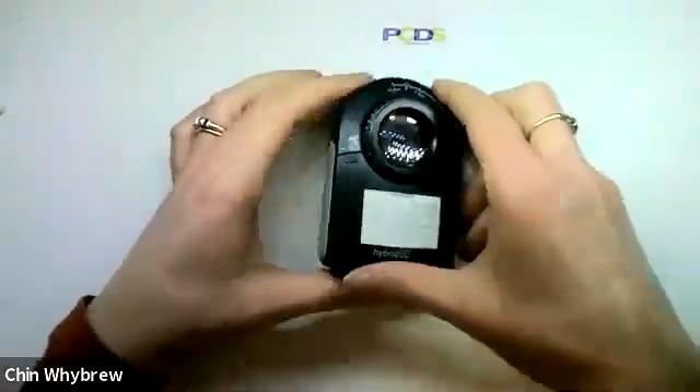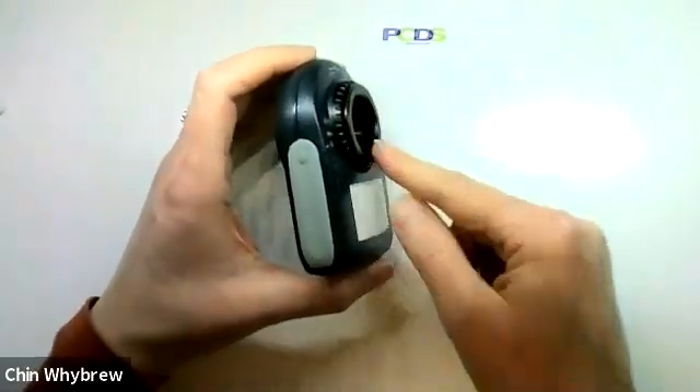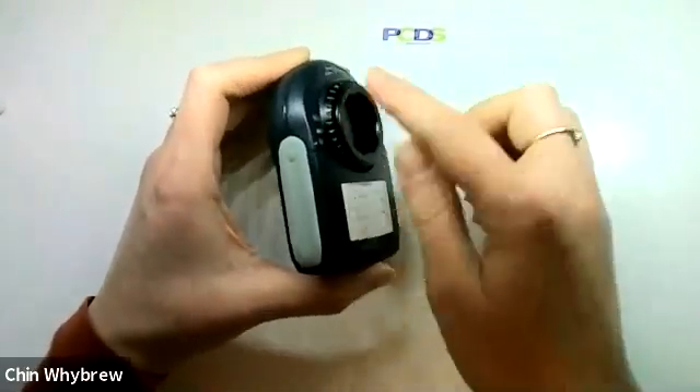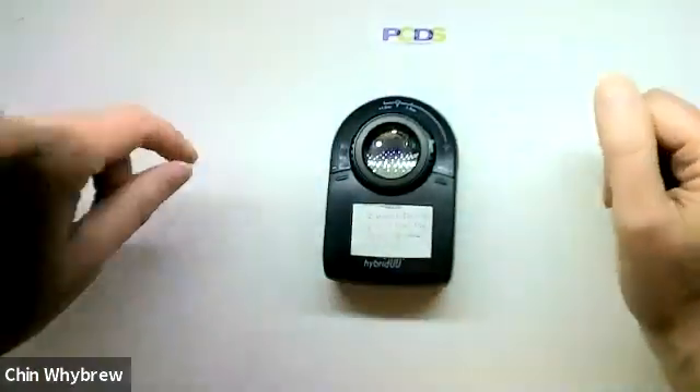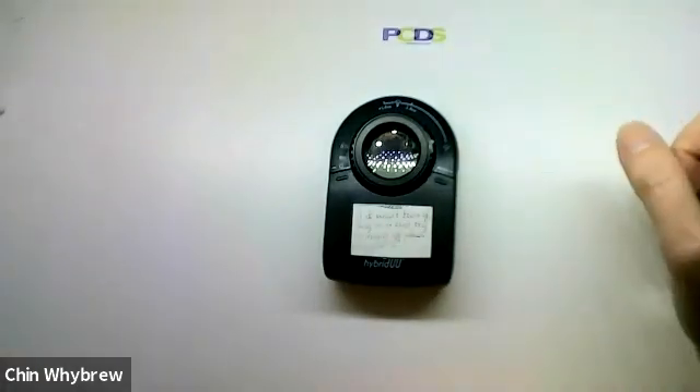The only downside with the leather case is that it's quite hard to fit it in when you've got the magnetic ring attached, but it does just about fit, and it has a clip on it for a belt.